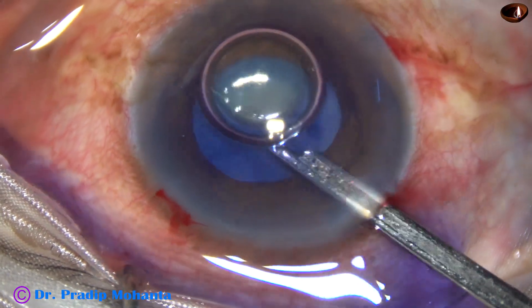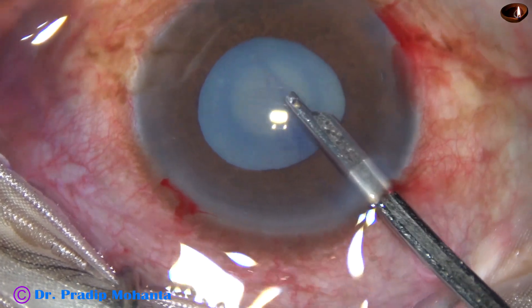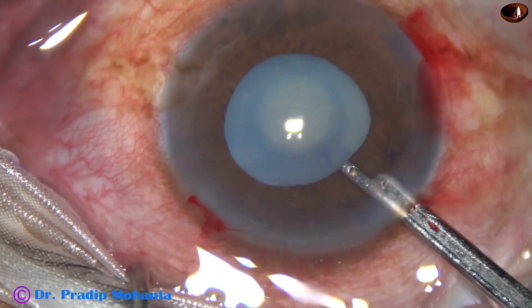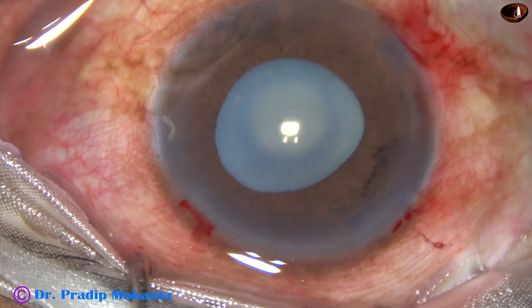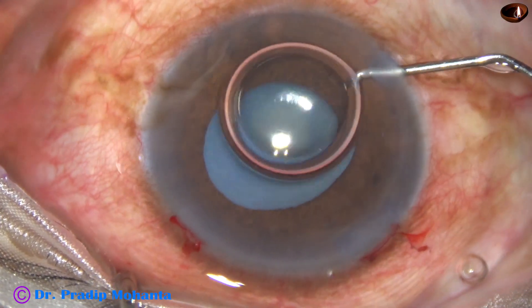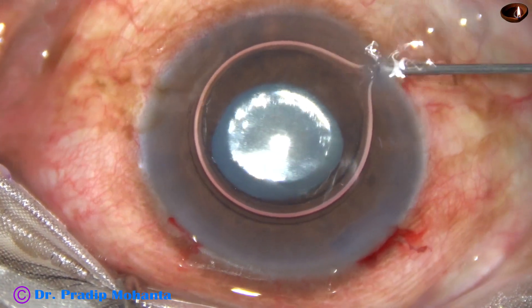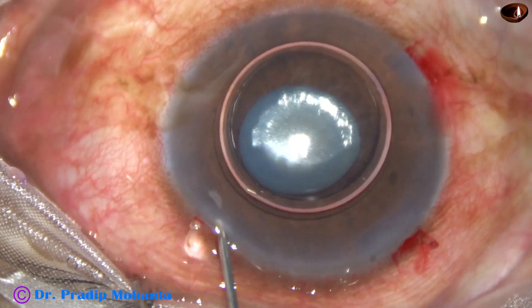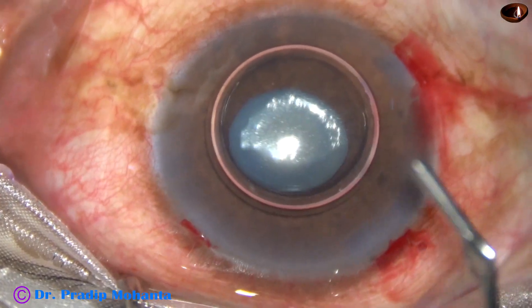Now we can see that the pupil has not dilated well. Size of the pupil is about 3.5 to 4 mm. So my plan is to use adrenaline after washing the dye. I inject an air bubble again, and then inject preservative-free adrenaline for intracameral use. This is epinephrine from Sanofi.